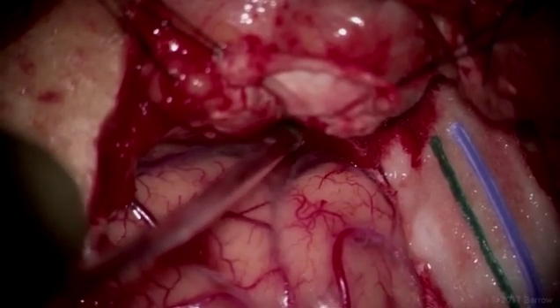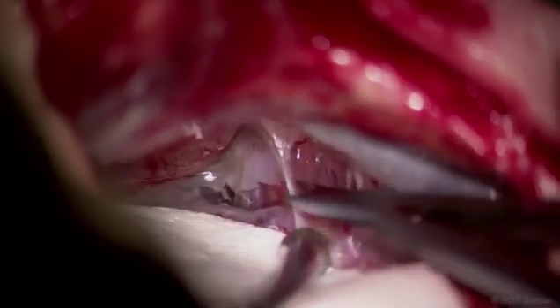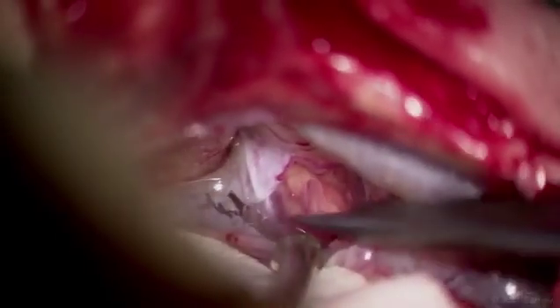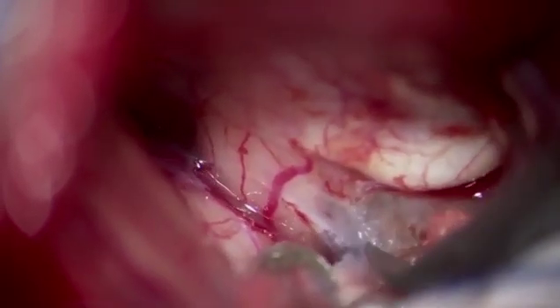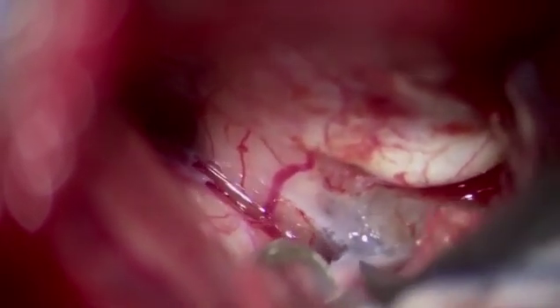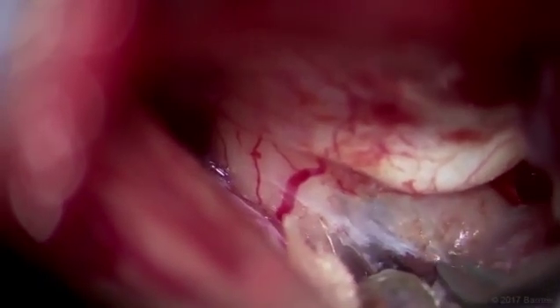Using an orbitozygomatic craniotomy, the sylvian fissure is widely split to arrive at the basal cisterns. Opening of the cisterns over the carotid artery allows for release of cerebrospinal fluid. The key to performing this operation is for the surgeon to develop a working trajectory lateral to the third nerve. When doing so, arachnoid bands tethering the third nerve to the tentorium and the temporal lobe are cut sharply, allowing the third nerve to be medially displaced.